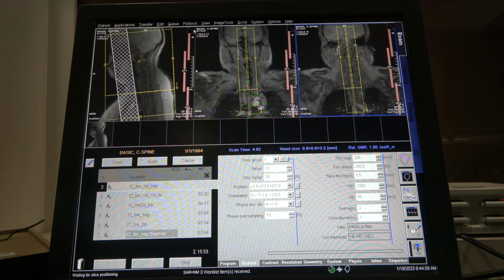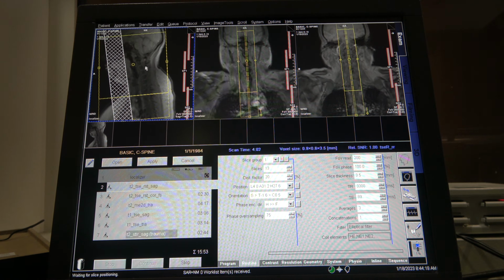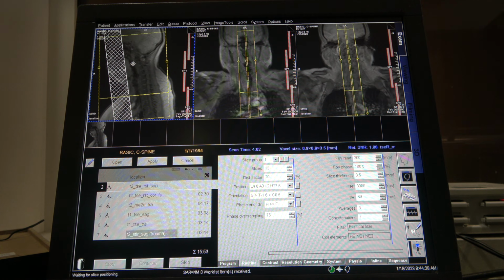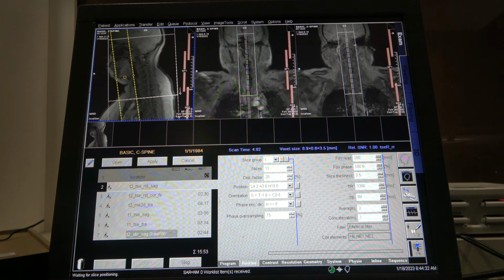All right. So we're gonna count. Make sure we get all 7. If you can get T1, that's great. This one doesn't look. I'm gonna say that's 2, 3, 4, 5, 6, 7. This is T1, so we can get T1 here. All right. Want to make sure we don't get that. Put it where the spine's at. Want to make sure we get the whole spine here as well.